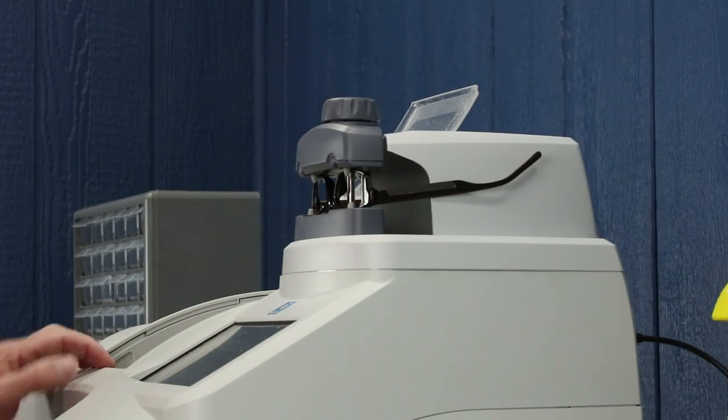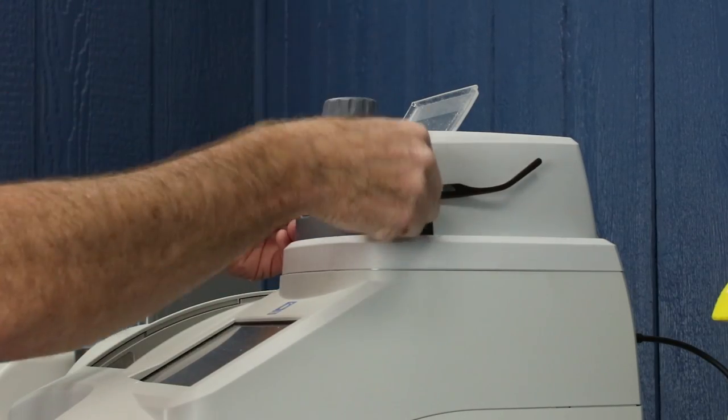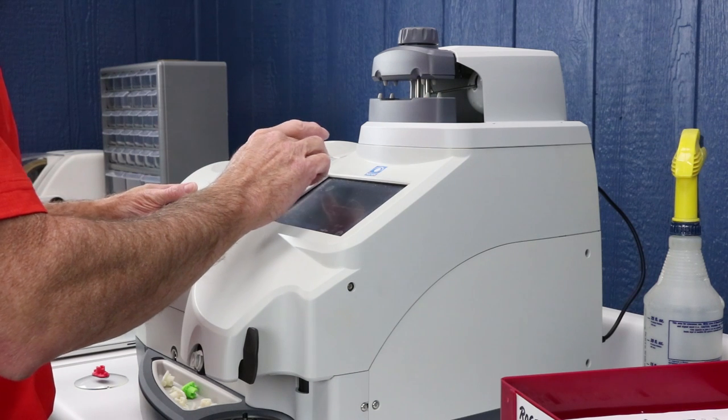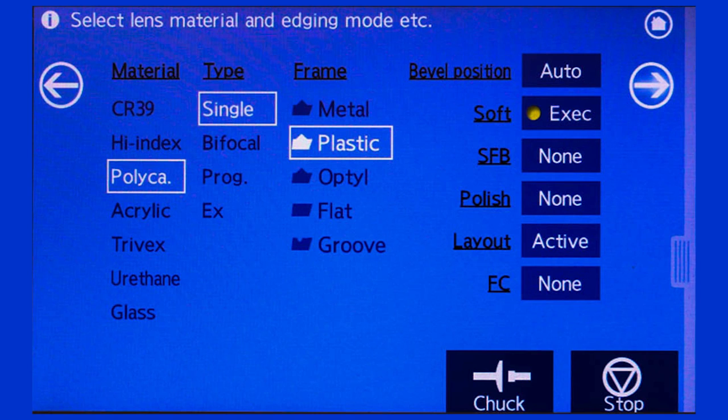Your frame is now finished tracing, so you can set it to the side and begin the data entry process. First screen is simply a confirmation. Make sure that you've got the right trace, right shape. The next screen is where you'll choose the actual lens material, the lens type, frame type, and any edge or settings like soft, safety bevel, polish, layout.